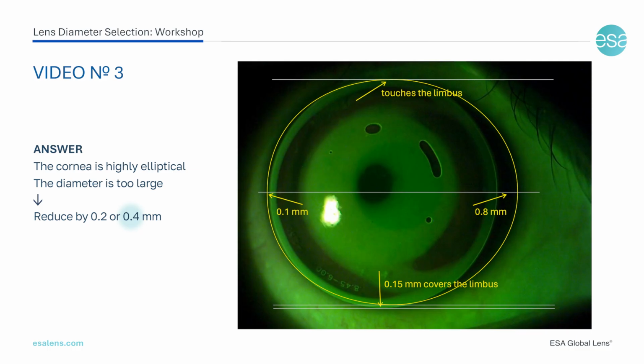It's important to note here that if this results in pronounced lateral decentration and the patient consistently complains of halos or double vision, it is possible that they may wish to discontinue the treatment. Ultimately, the patient would need to decide whether these visual imperfections are acceptable in exchange for the therapeutic benefits of the lenses.